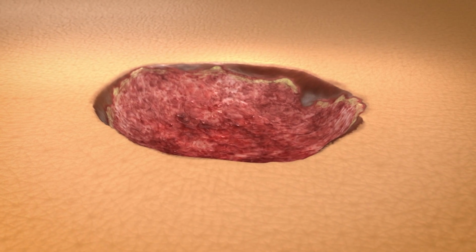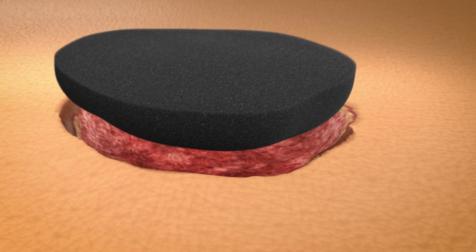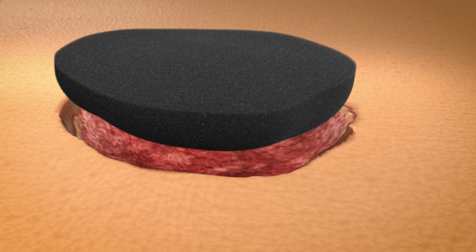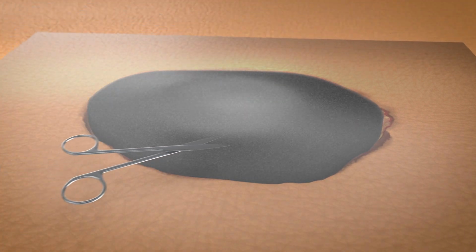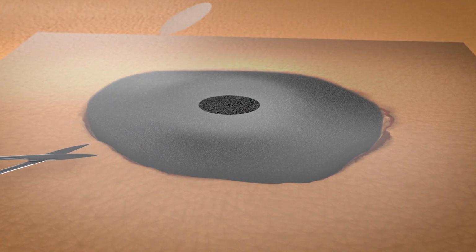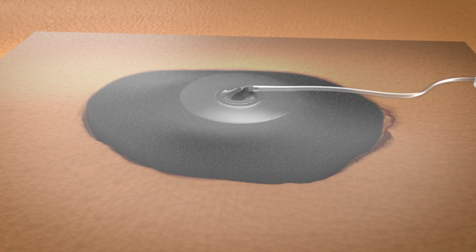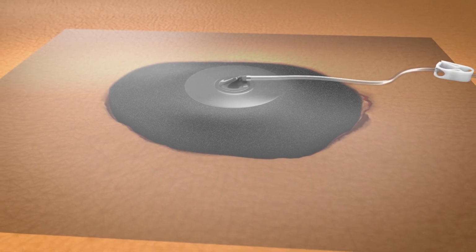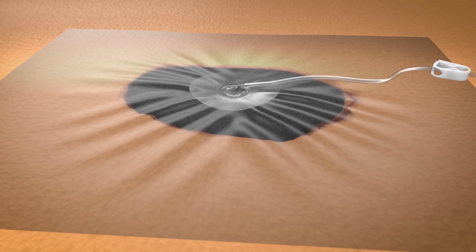When managing a wound using 3M VAC Therapy, the proprietary 3M VAC Granufoam dressing, which is a reticulated open cell foam, is placed directly into the wound bed. A semi-permeable drape is then used to seal the wound, provide a moist wound environment, and protect the wound from external contamination. The proprietary 3M sensor track pad and tubing are then applied to the drape and provide the connection to the therapy unit. 3M sensor track technology helps provide uniform negative pressure to the wound surface.